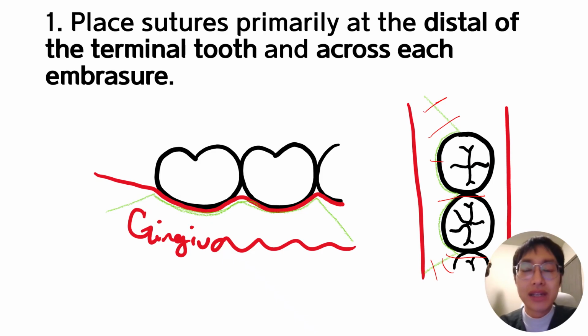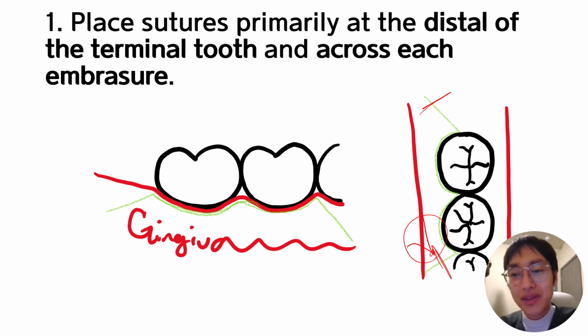It is easier because if you do the ties or suture from the front, okay, here are some knots there, and it might be disturbing you. But if you do it from the back area, of course, if you do the more difficult thing first, then it gets easier and there is better visualization, and the assistant needs to cut the thread at the end, right?